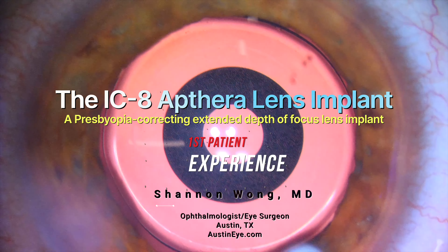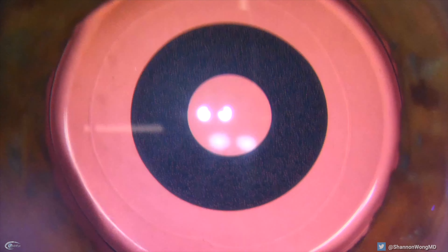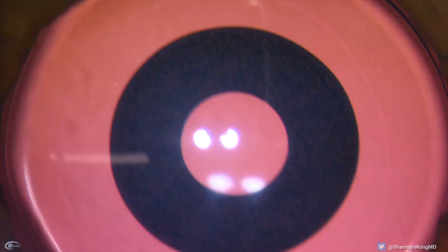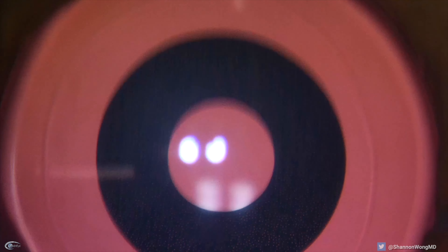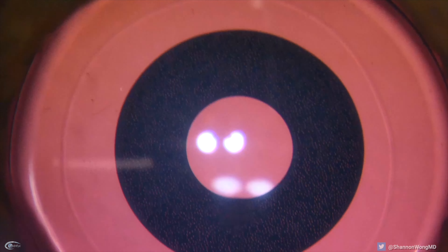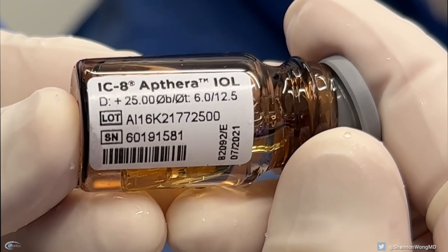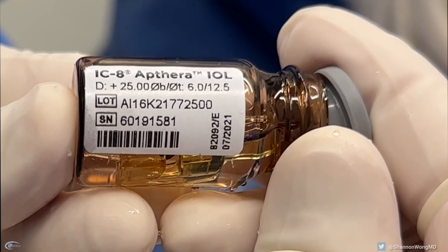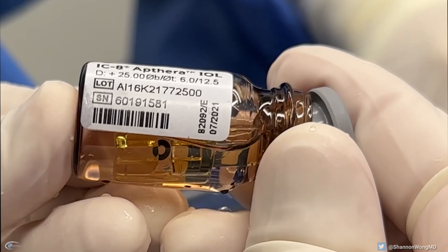This is Dr. Shannon Wong in Austin, Texas. We recently placed our first IC8 presbyopia-correcting extended depth of focus lens implant this past week. I thought it would be enlightening to show you what the lens looks like in the operating room and through our operating room microscope, and then let our first IC8 patient share his experience the day after receiving the IC8 lens to help him read up close without glasses.